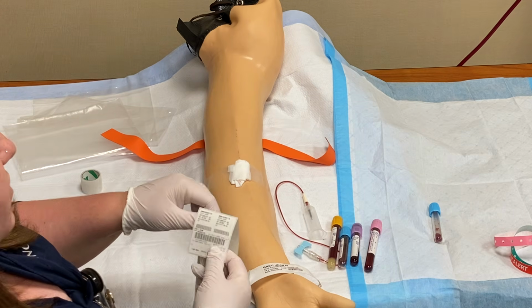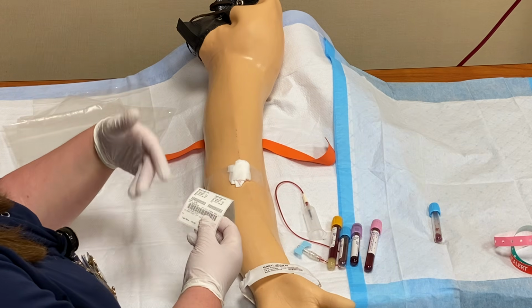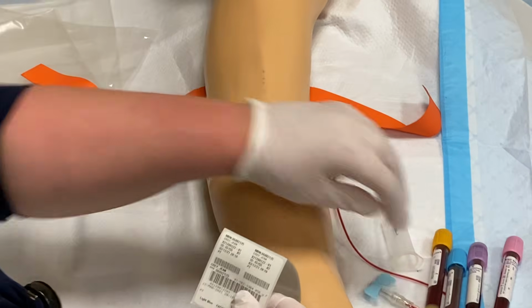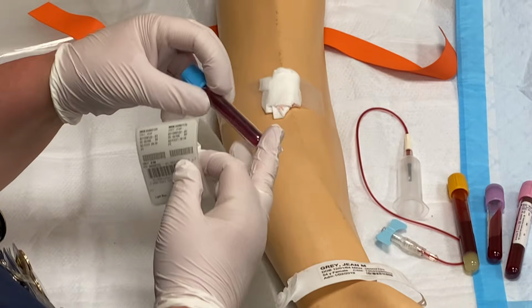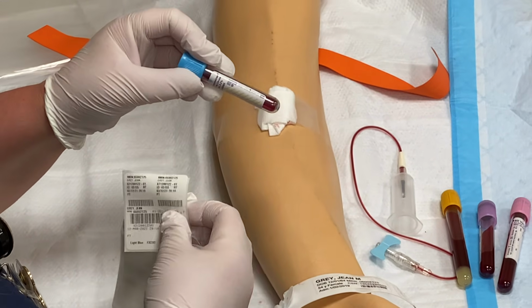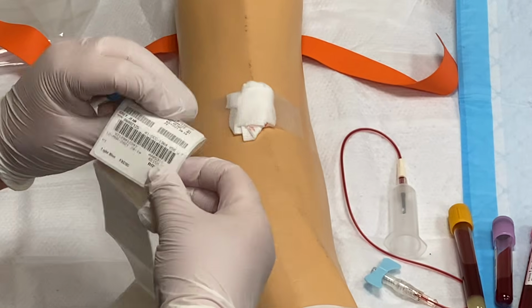And I'm gonna label my tubes. It doesn't matter what order you label them in, I always start from the bottom. So the first label I have is light blue. Since my blue tube is a short tube, I wanna make sure that I get this labeled pretty close to the colored top to make it easy for the lab to read.